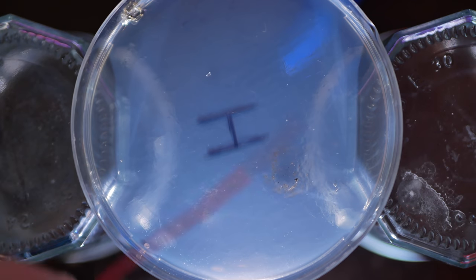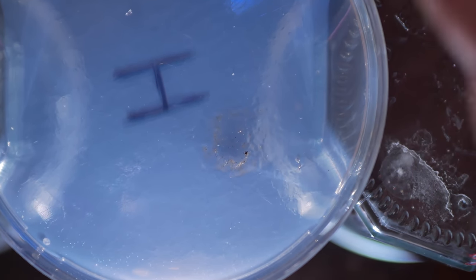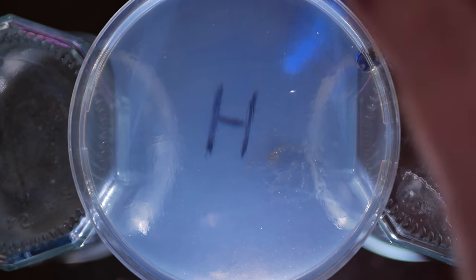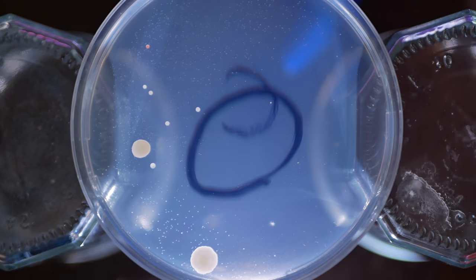This is completely devoid of life, but we also kind of damaged the surface in the process. And here's the second hot plasma plate, third plate. You'll notice none of them had growth on it, but they all were damaged. This is the cold plasma treatment.